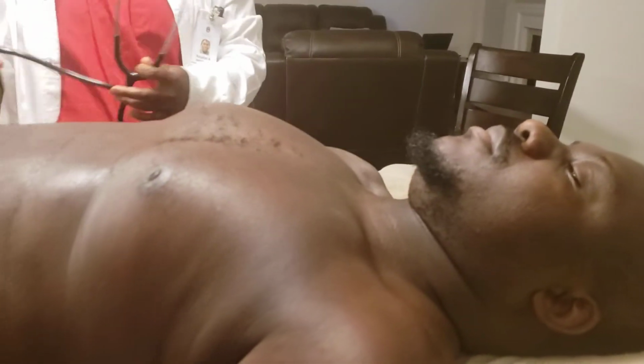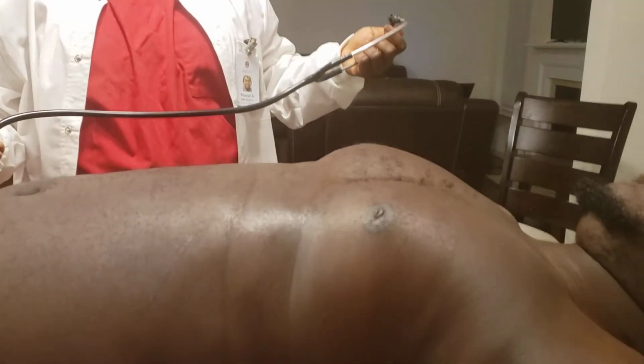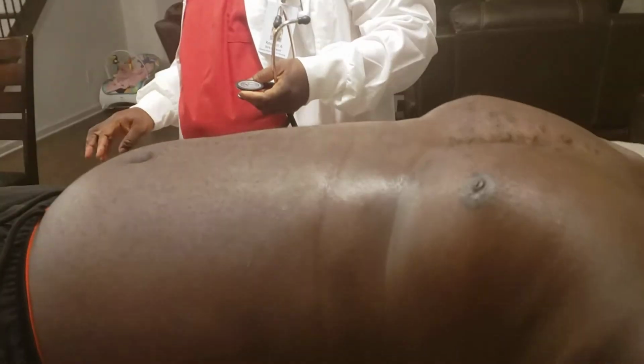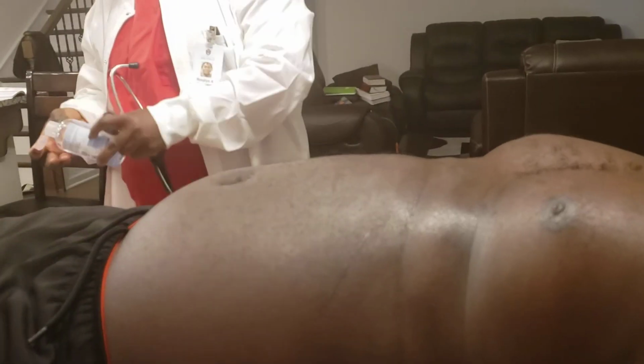Let me take this pillow. Go straight down for me. I'm going to auscultate 5 locations for your heart sounds. And I'll clean my diaphragm, I'll wipe it clean before I use it.